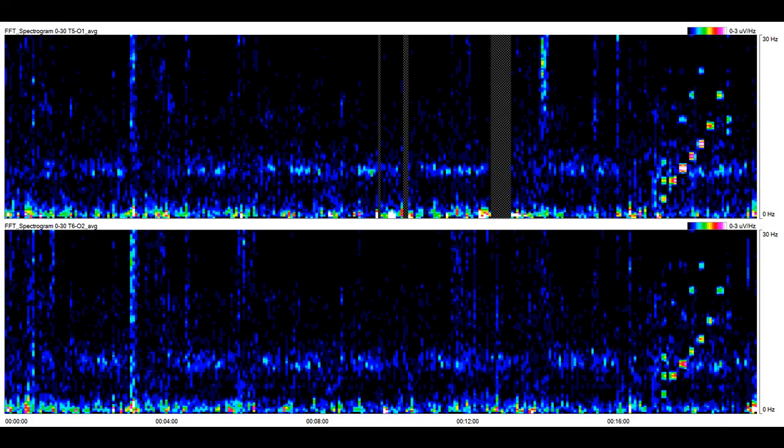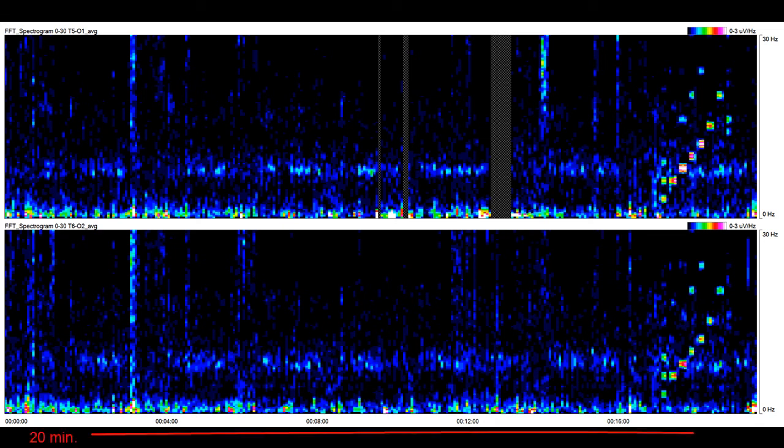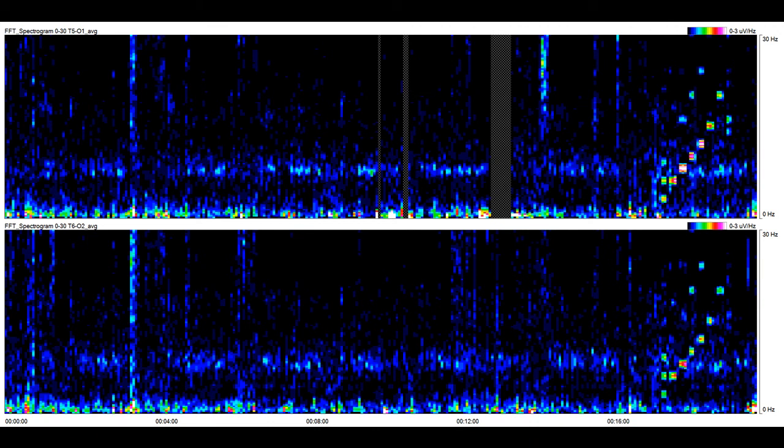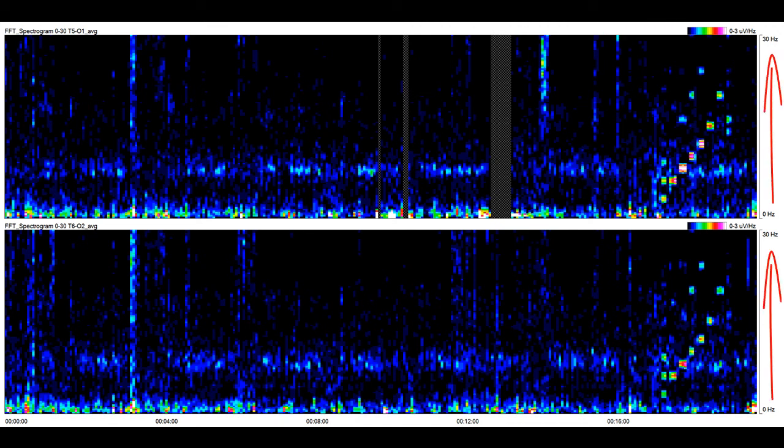Now let's shift back to a time axis duration more typical of that used for continuous EEG trend monitoring. Here's a 20 minute view of the FFT spectrograms from the same recording that we've just been studying. The upper graph shows data from T5 to O1, and the lower graph from T6 to O2. An RGB color scale is used for the z-axis, and frequency from 0 to 30 Hz is shown on the y-axis.